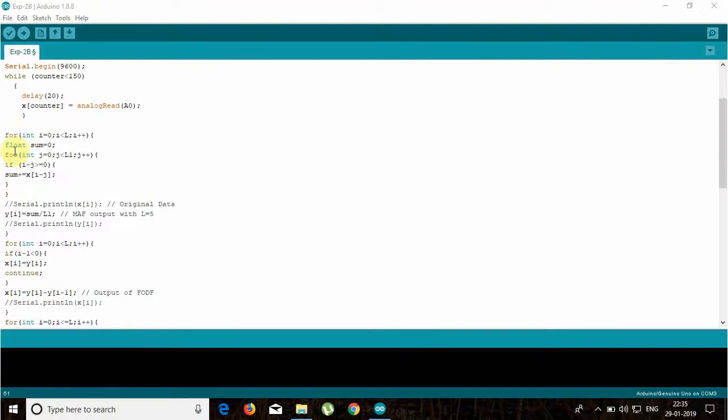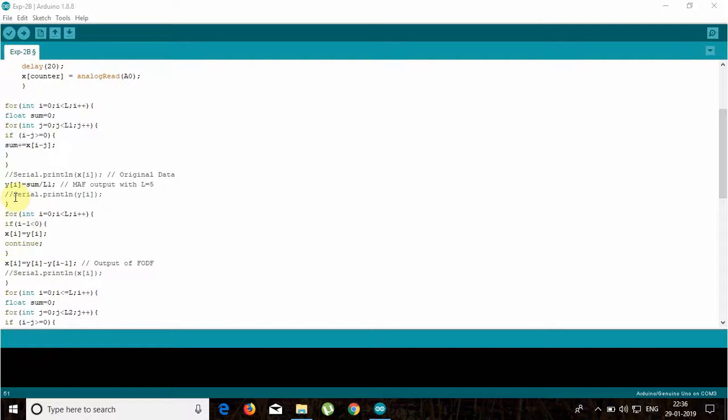In this loop, we will calculate the output of the first moving average filter. The order is 5 and we will calculate the sum and then divide it by 5. This is the command for printing the output of the first moving average filter, and this is the command for printing the original data, plotting the original data.